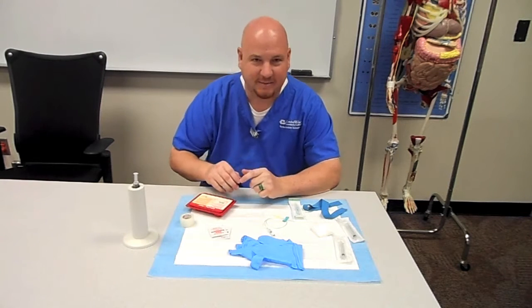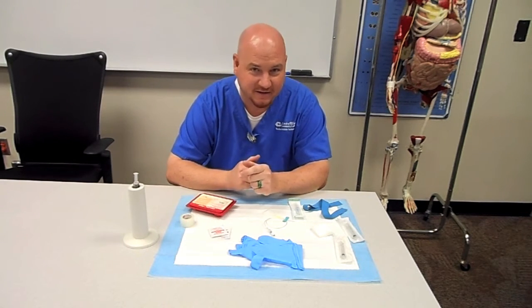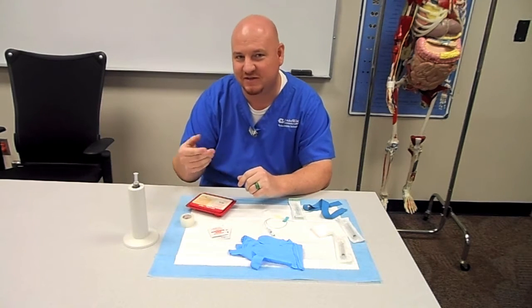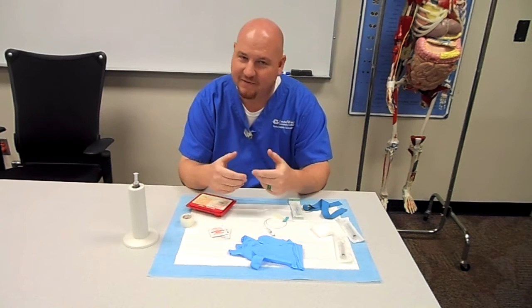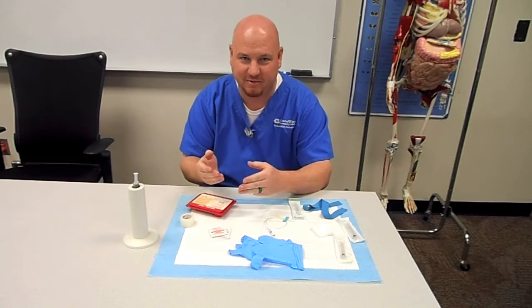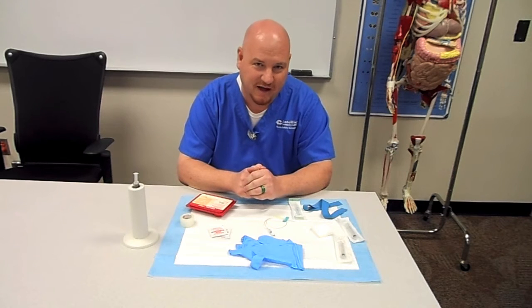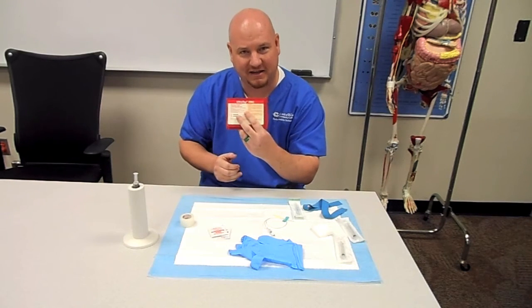Hi, I'm Matt and I'm going to be explaining to you today how to mix an UltraTag kit. When you're starting off in nuclear medicine, you may not realize that it's not just injecting people with radiopharmaceuticals — sometimes we actually have to work with the blood because the blood itself is going to be our radiopharmaceutical. In order to do that, we need to first do a blood draw and then to get a really good tag, we'll use this UltraTag kit.